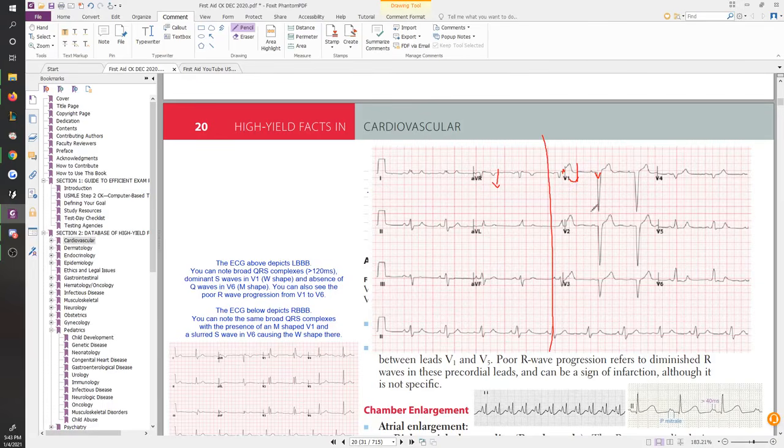So we look at it, we can see that there's something wrong throughout the entire right side. So we can pause that, take a look at what's happening on the left. We come over here to the left side, and if you're looking at 2, 3, and AVF, I'm not really able to notice anything very abundant immediately. Nothing crazy is happening over here. And then if you look at 1, 2, and AVF to figure out the axis deviation, well, 1 is pointing up, 2 is pointing up, and AVF is pointing up, so there's no axis deviation. That's normal axis. So then you have to see what could truly be going wrong.